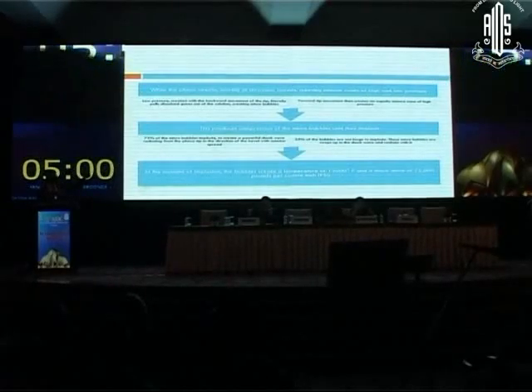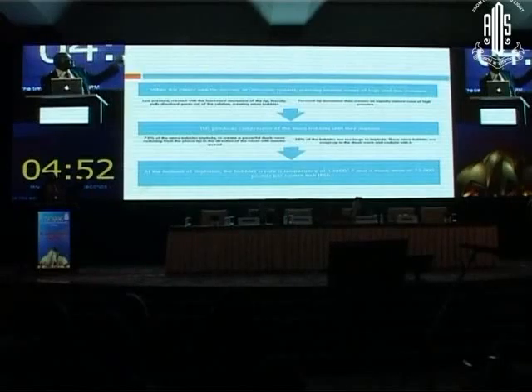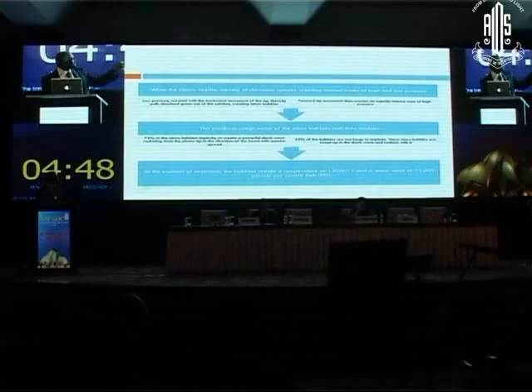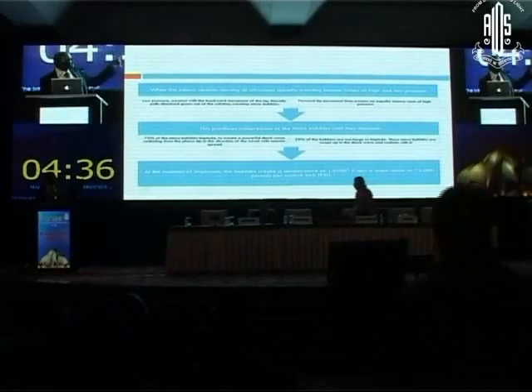The forward tip movement then creates an equally intense zone of high pressure, and this produces compression of the micro bubbles until they implode. 75% of the micro bubbles implode to create a powerful shock wave radiating from the phaco tip in the direction of the bevel with an annular spread.